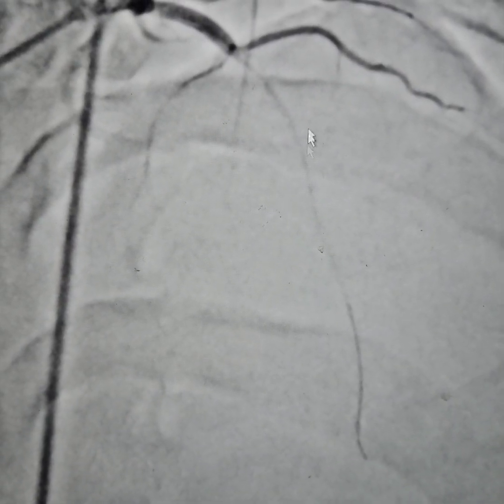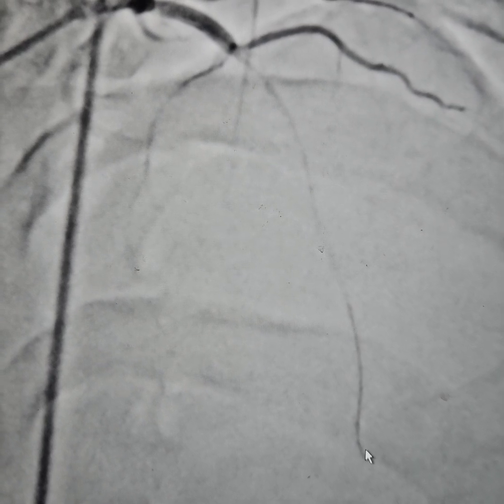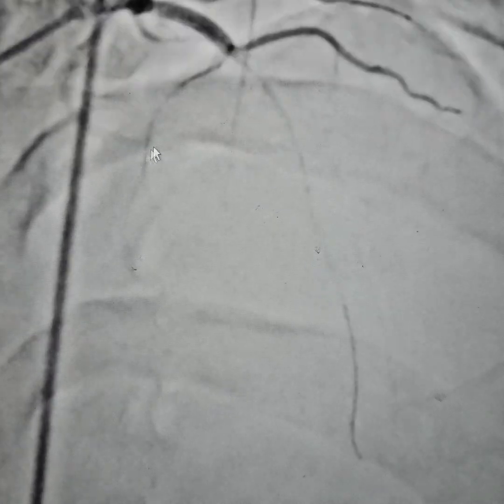We placed the LAD wire distal to the lesion, and we can see that some flow has started coming as soon as we crossed the wire — this is a good sign. Predilatation is very important in these cases, and direct stenting would never be attempted here.